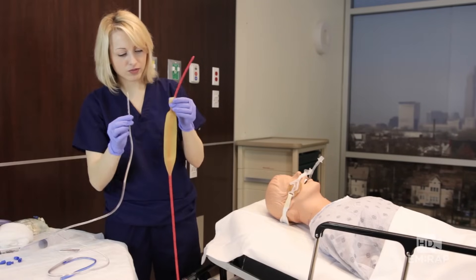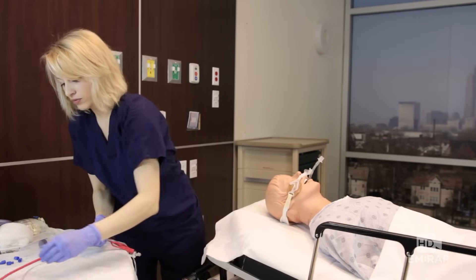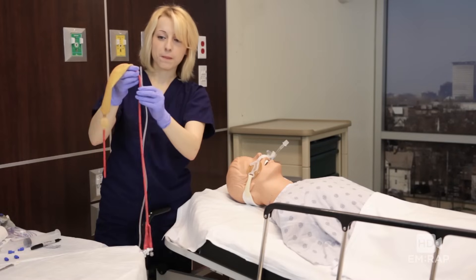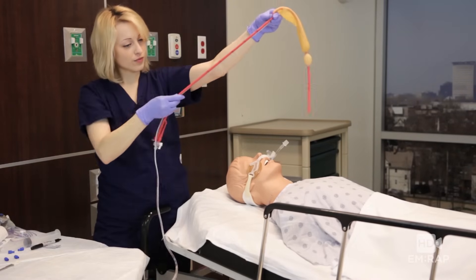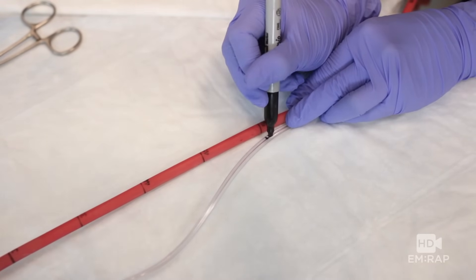Take your OG tube and line it up so the tip is just above the gastric balloon. At the 50-centimeter mark on the Blakemore tube, label the OG with a G. Now line it up so the tip of the OG tube is just above the esophagus balloon, and at the 50-centimeter mark on the Blakemore tube, label this with an E on your OG tube — this will make sense in a minute, I promise.